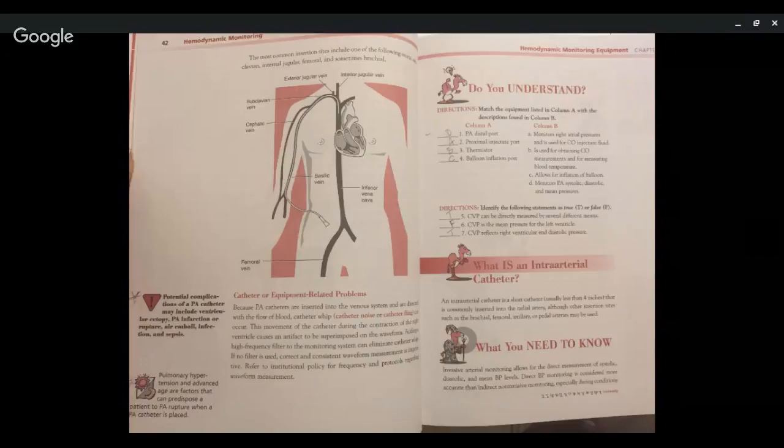Okay, so number 6, CVP is the mean pressure for the left ventricle. That is false. CVP is the mean pressure for the right ventricle. No. CVP is right atrial pressures.